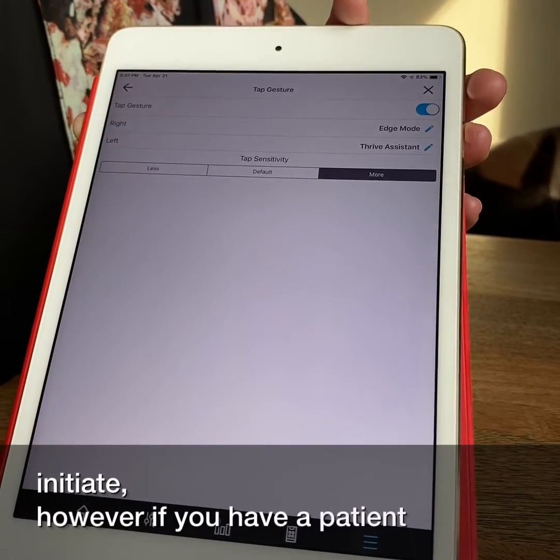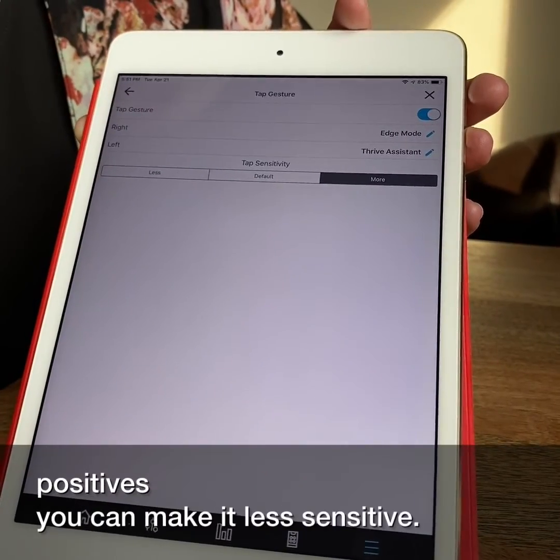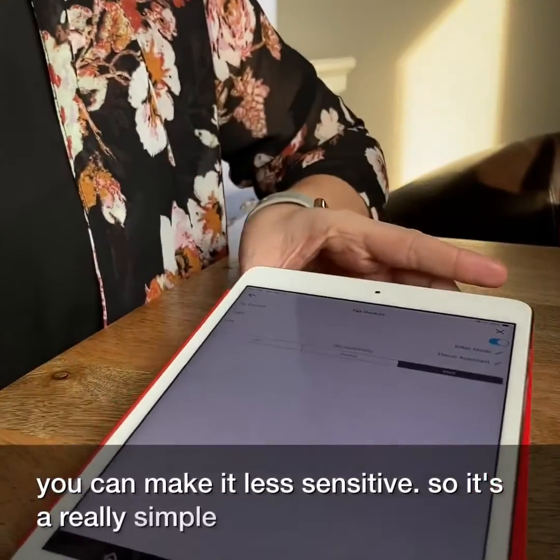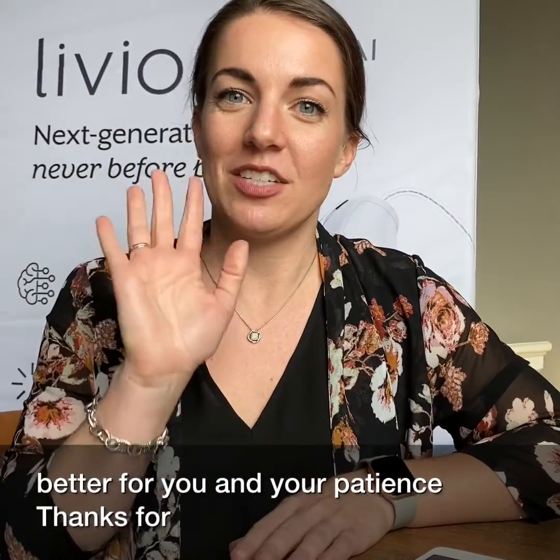However, if you have a patient that's complaining of a lot of false positives, you can make it less sensitive. So it's a really simple adjustment to make the double tap feature work better for you and your patients. Thanks for listening.